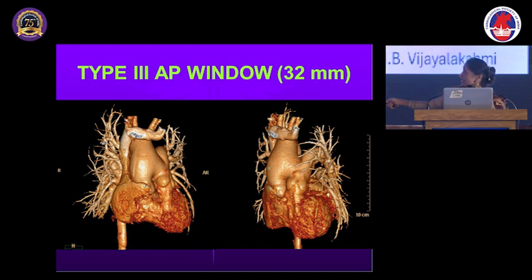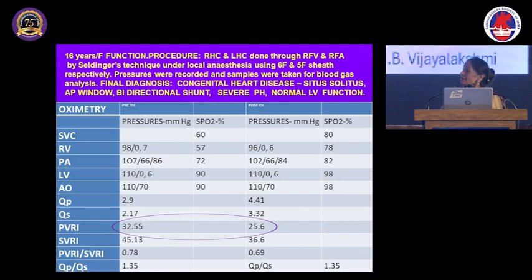That means the vertical vein is caught between the left pulmonary artery and the left bronchus, and as a result the compression can cause obstruction to the vertical vein, and that can be made out only by the pullback tracings, and this is very important for the surgeon to make out.